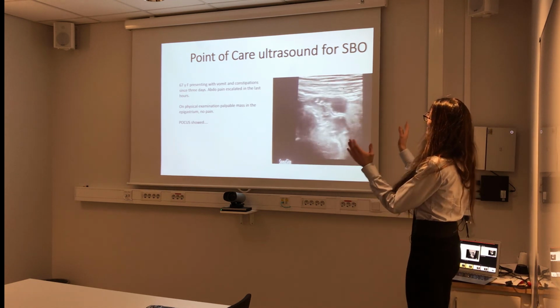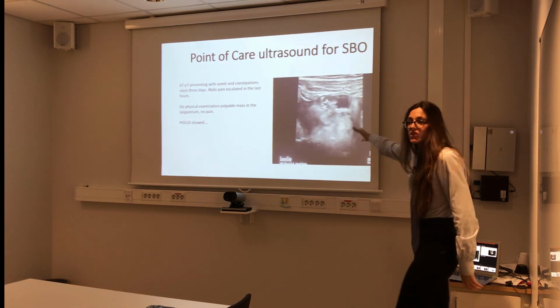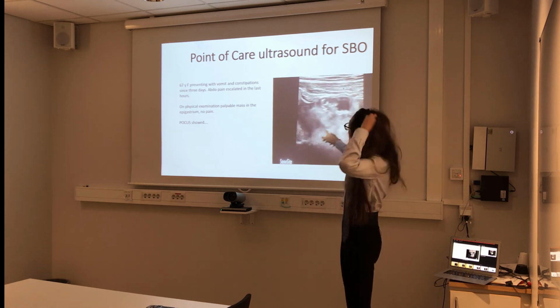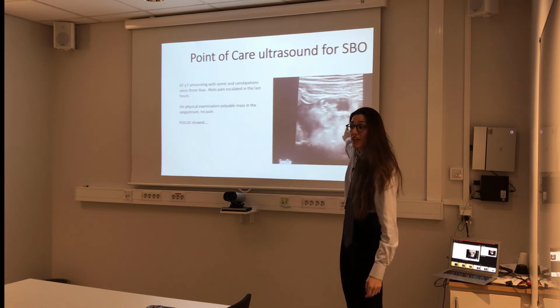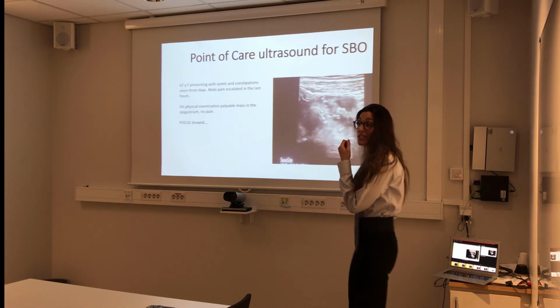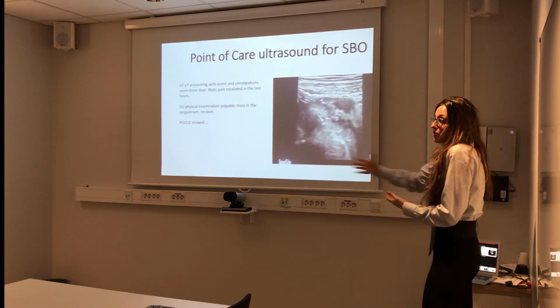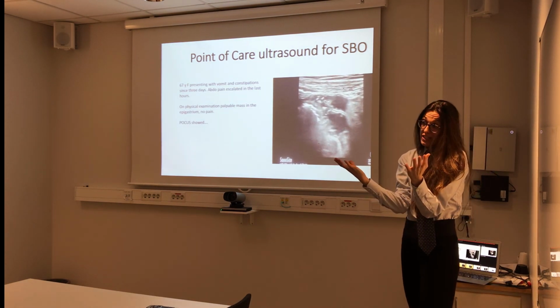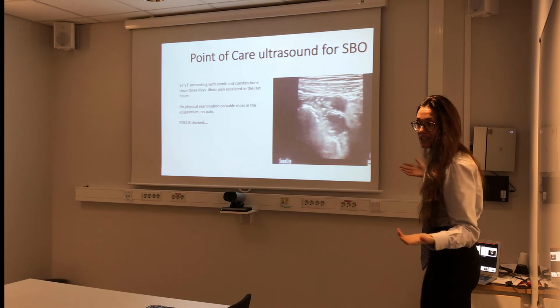And it was not clear, because here I can see an ileus or subileus, but I cannot tell you why. This patient needs a CT for sure, because this is somebody coming in with something weird. It's very important because I did a FAST, there was no free fluid, but I could find this. So I said there is a sign of ileus, and then the CT confirmed it: there was an ileus because of the cancer lying behind. So in this case, it's not a straightforward intussusception in a kid, which is easy to get, but somebody who has a secondary complication due to something else.